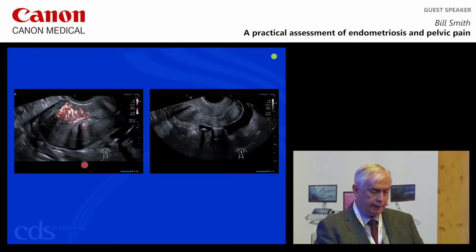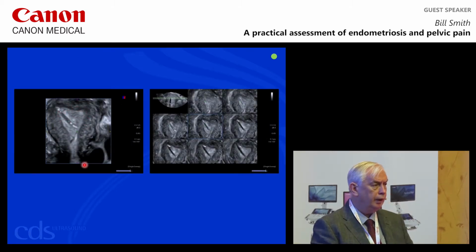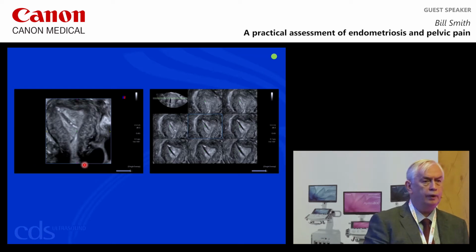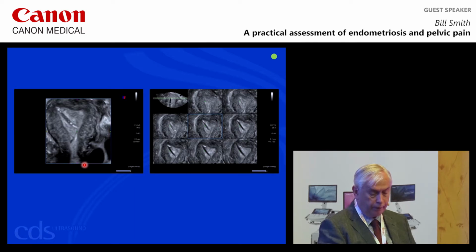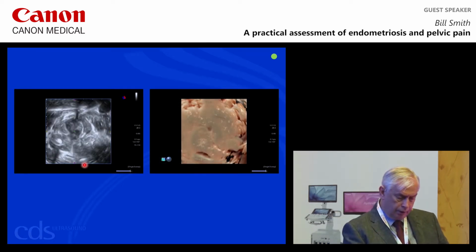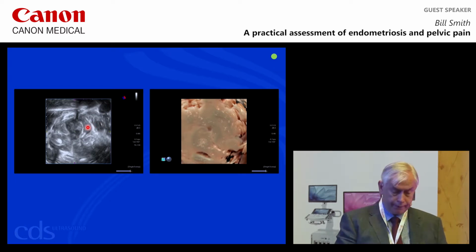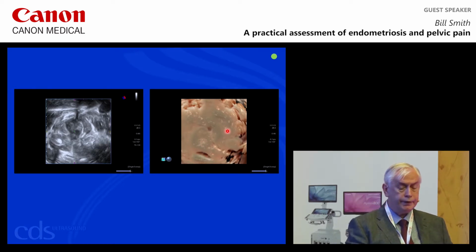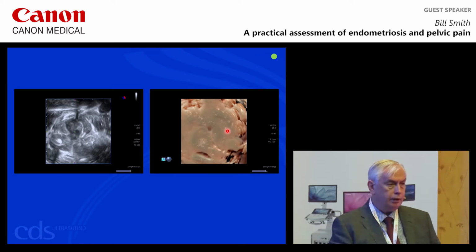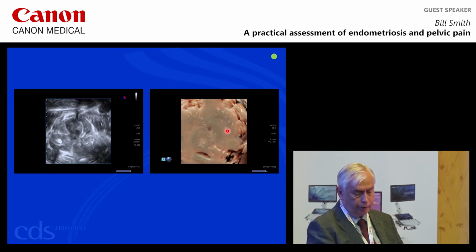And if we take this case here, again, it's pelvic infection. We have the complication of a coil there. We're not quite sure what that Mirena coil is doing. It seems to be twisted and heading towards the right interstitial tube. And just in the corner there, we have a pyosalpinx. And the ovaries here, the pyosalpinx is there on our shadow glass image. So those are causes of pelvic pain emanating from the uterus.